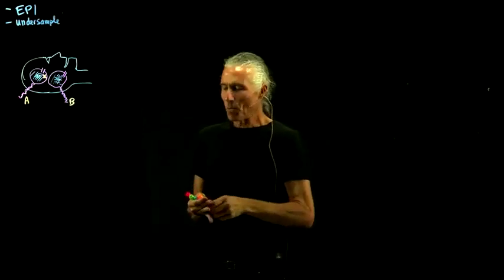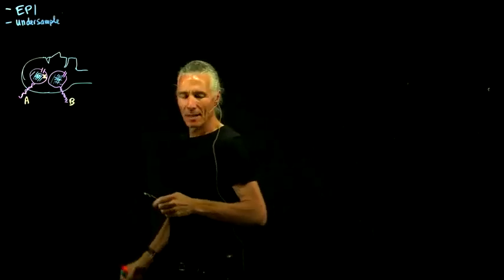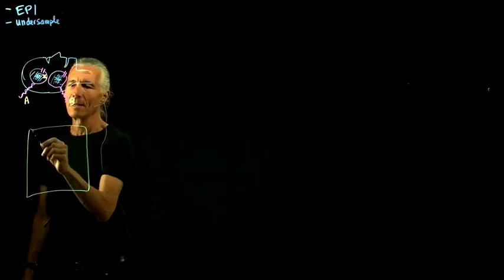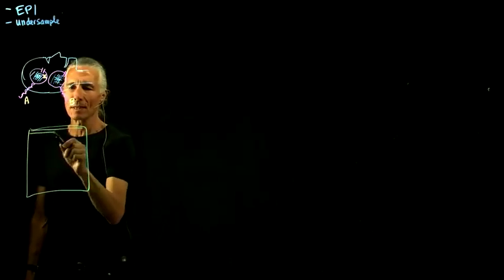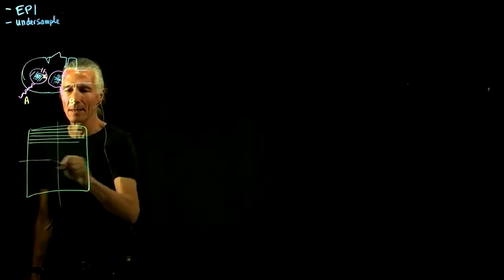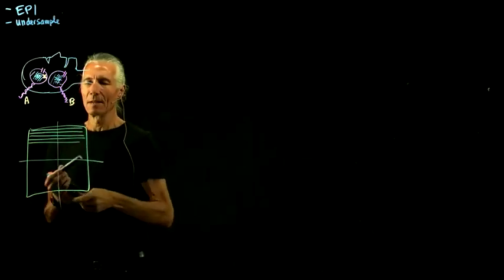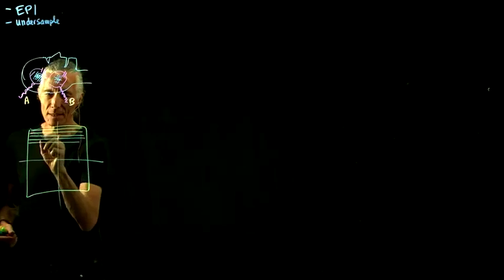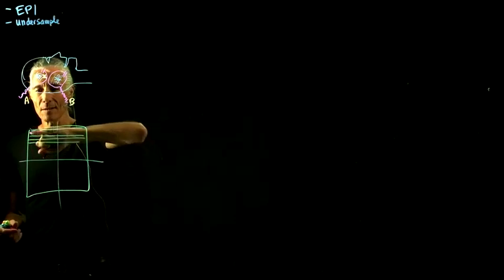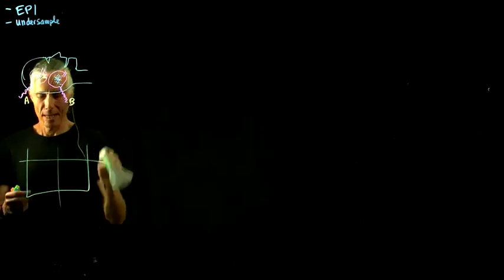So first of all, what is the problem if we just go ahead and leave out the data? That's not going to work. In the homework, there's a problem to zero out every other line. So here's k-space. What if we just block out every other line? A lot of times we can say that we're zeroing it by just making a dashed line.